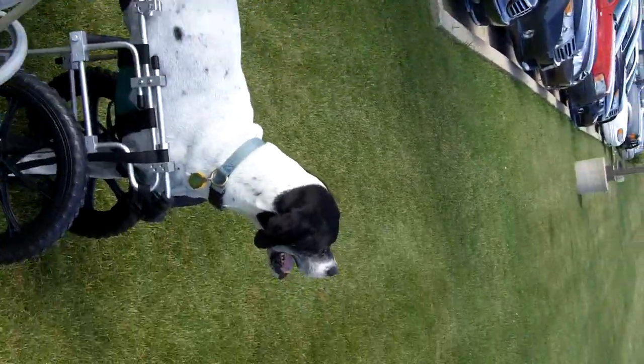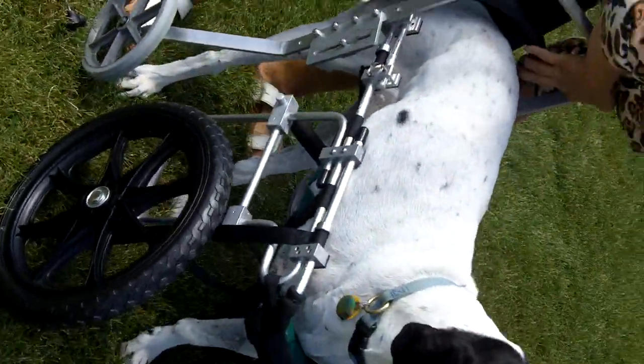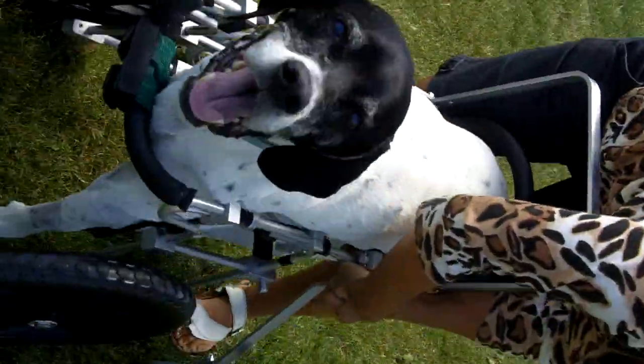Okay, I'm just going to put that one in now. As I said, I do the left side first because the left side is fitting better.